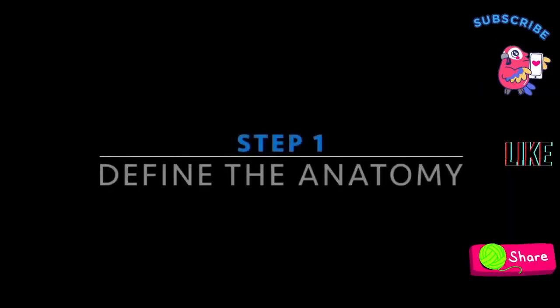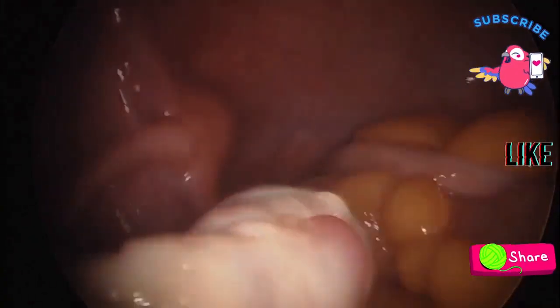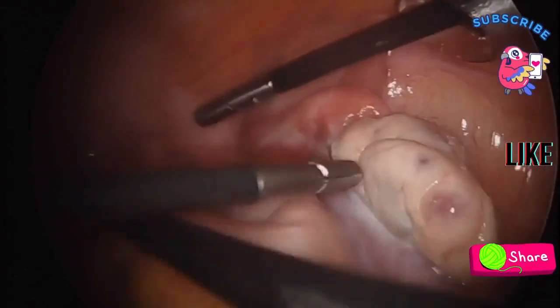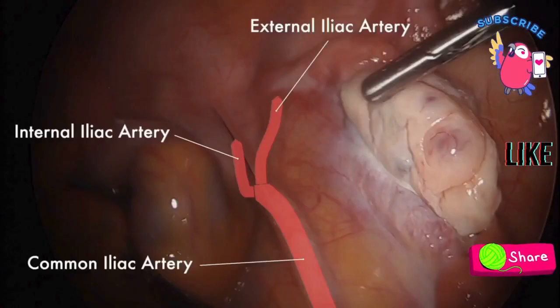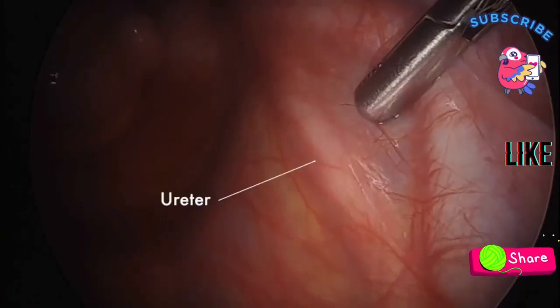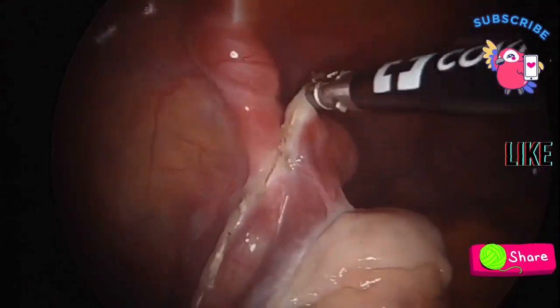Step 1. Define the anatomy. The left hemipelvis contains a normal ovary and fallopian tube connected to a uterine remnant. There are no midline gynecologic organs. Anatomic variations are more prevalent in patients with Müllerian anomalies. On the right, the common iliac artery runs deep into the pelvis before bifurcating into the internal and external branches. The ureter is underneath the common iliac artery. For ovarian cancer risk reduction, a bilateral salpingectomy is then performed.